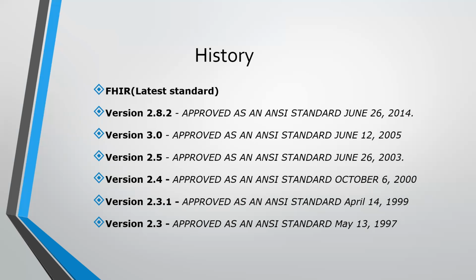But when 3.0 was introduced to the market, people saw that it is a complete shift in the message structure, a complete change in the architecture and everything. So 3.0 was not at all similar to 2.x.